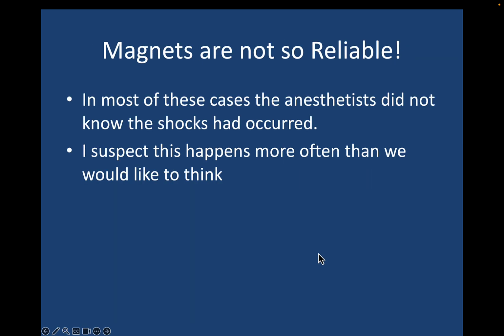So the concept here, I think, that you'd want to take home is that magnets are not so reliable. In most of these cases, the anesthesiologist didn't even know that the shocks had occurred. They were detected in postoperative assessments, postoperative interrogations. And I suspect that this happens a lot more often than we would like to think.